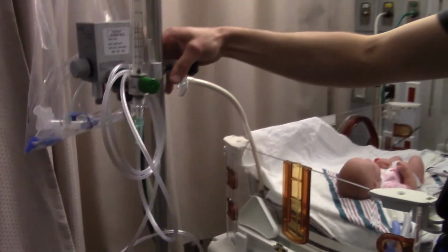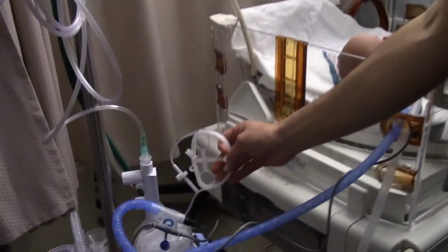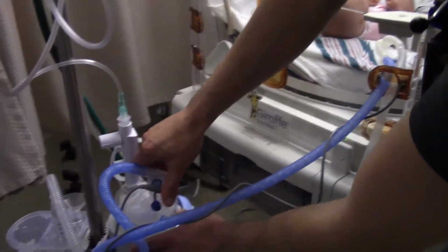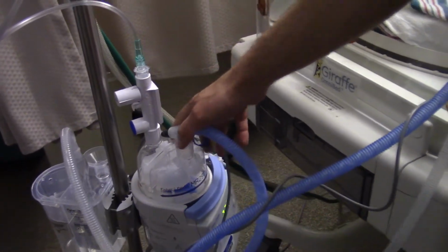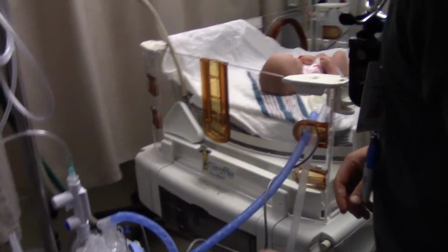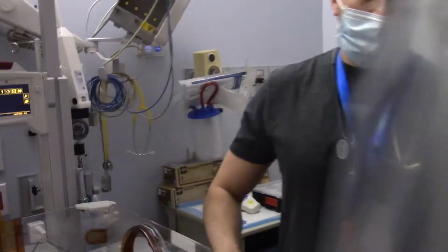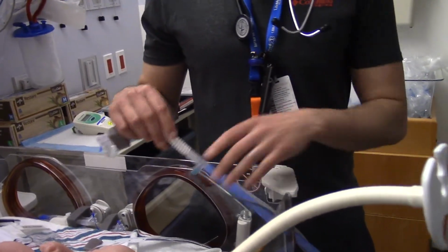Okay, so now we've got everything there. As Brian was saying, that's where your water bag is going to connect, right up there. Most everybody has seen or had a baby on bubble CPAP, but we do have some new nurses coming in, and they've all been fantastic, and we want to continue that. So about a year ago, we standardized our system, our interface, and the entire setup that we use here. We're using the Fisher-Paykel system. It's exclusively the only one we use.